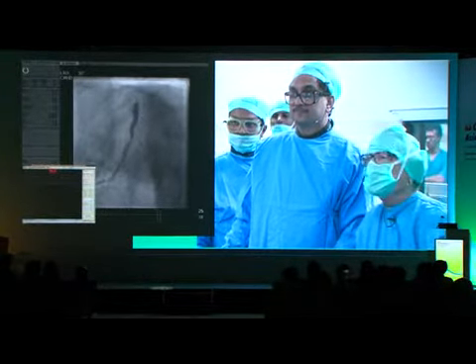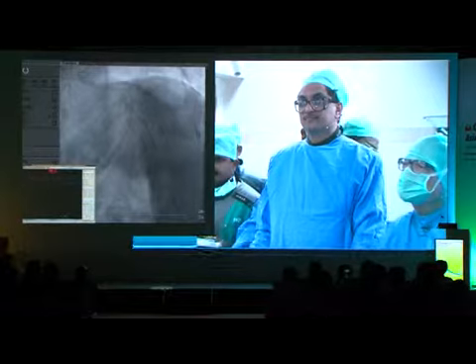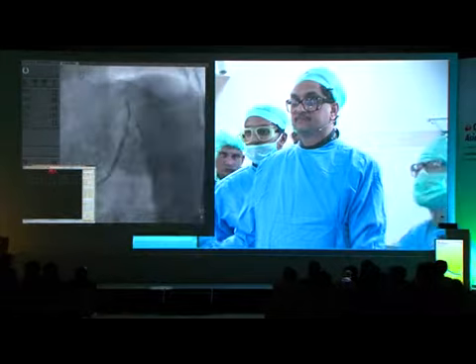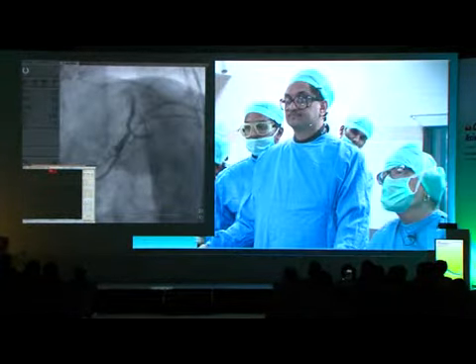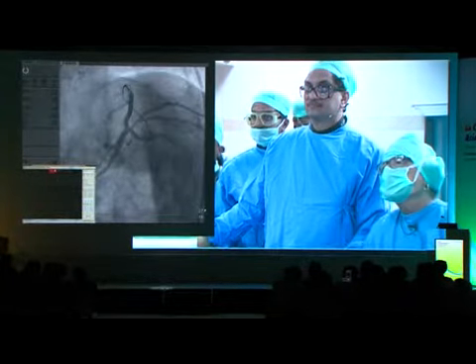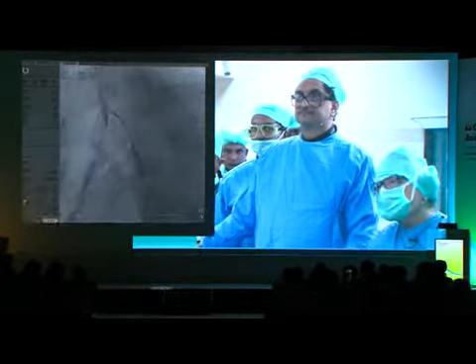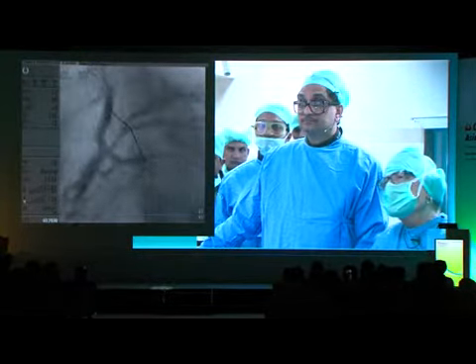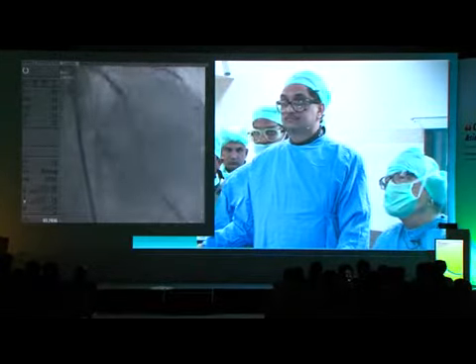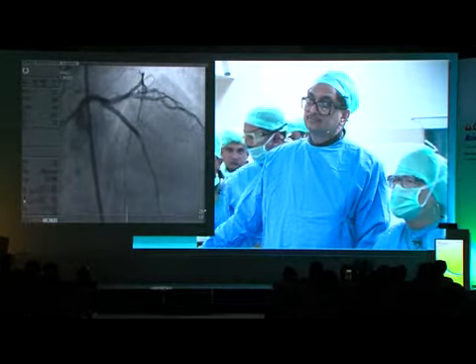And this was the opening of the stent. The control angiogram. You see that in terms of positioning it's really optimal, because there is no damage to the obtuse marginal of the circ. And you see, we are exactly at the good positioning. Distally, the stent is bigger than the artery. And if we check, you see that there is a minimal dissection distally.